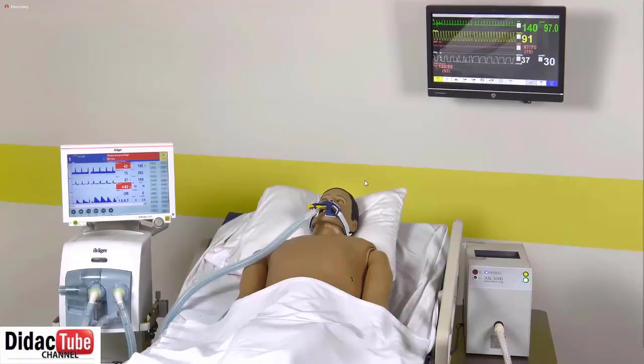In today's scenario, we use a SimMan 3G. And a fun fact about the ASL5000 breathing simulator, there are over 1,000 ASLs in the world being used for educational training and research and development.